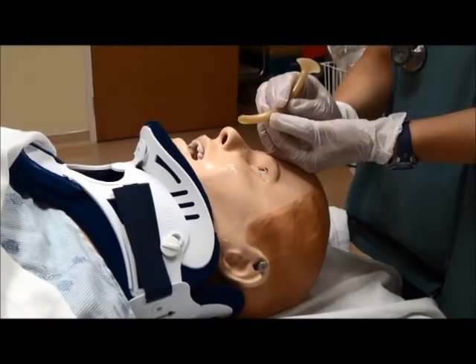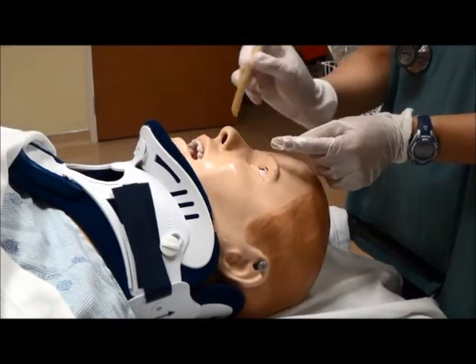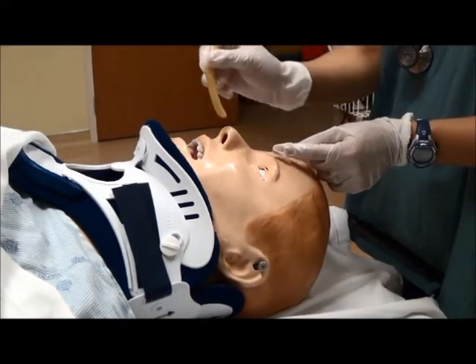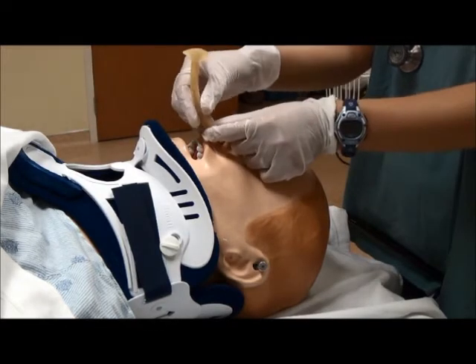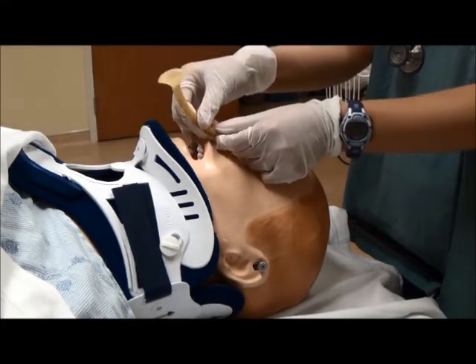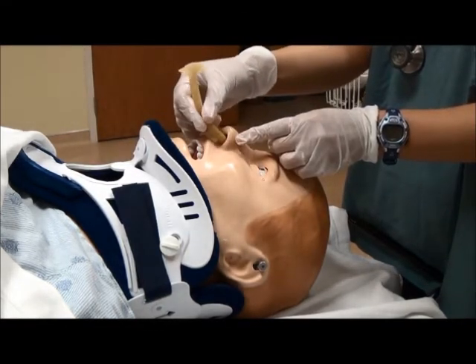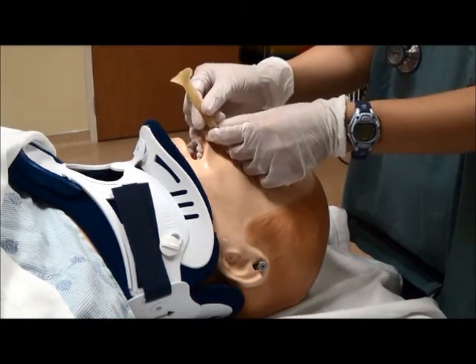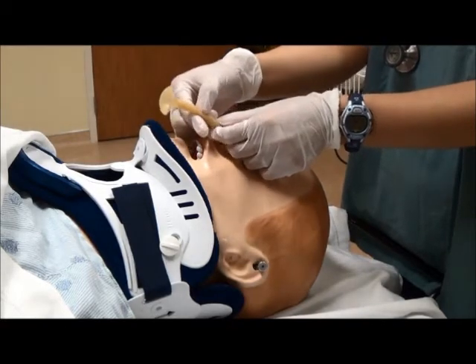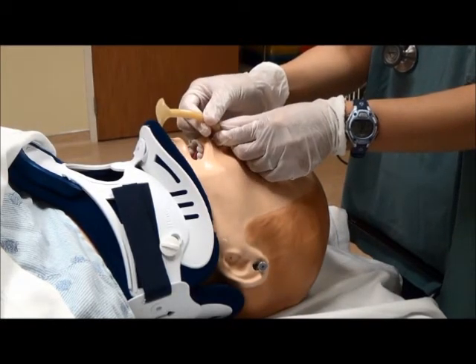To insert in the left nare, point the bevel towards the septum. Insert the first half, then rotate the nasopharyngeal airway 180 degrees, and insert the second half.